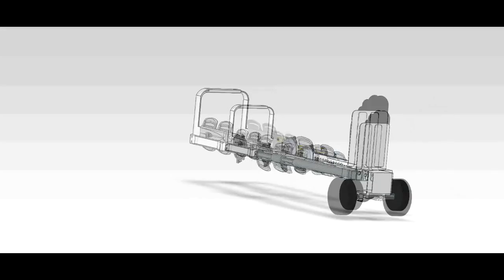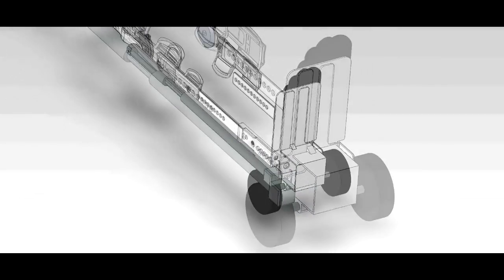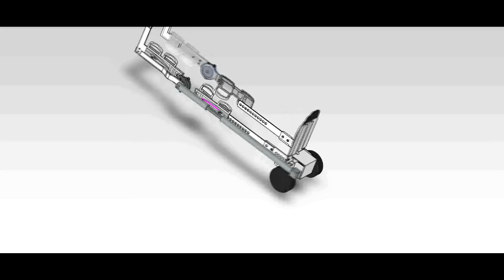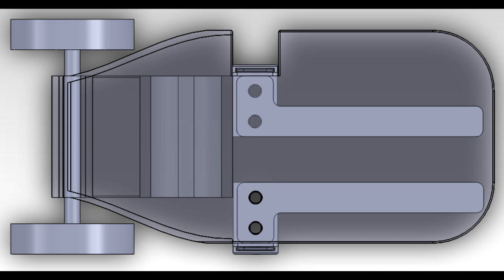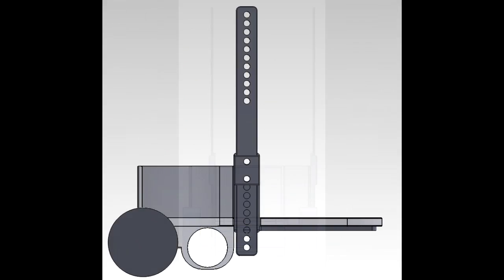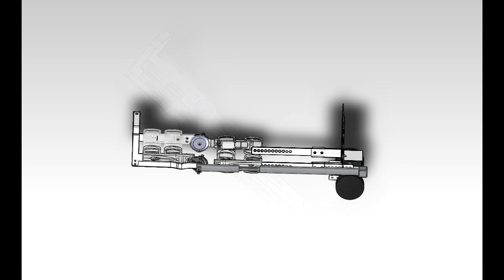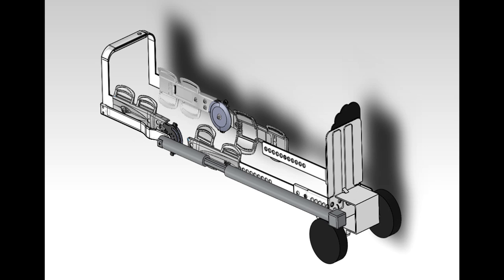All of these proposals were equally examined and compared based on several key criteria needed for our device. The system needed to be lightweight, small, and provide the necessary power to move the leg as prescribed without exceeding our budget. Upon comparison, we noticed that the safety of the chainring as well as the cable-driven systems were much too uncertain for use within a medical practice on the patient. The hydraulic system was quite strong, but was not very cost-efficient. The drive shaft mechanism proved to be the safest and most efficient means for pursuit on our device production.